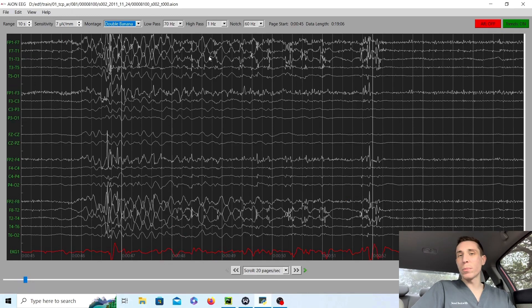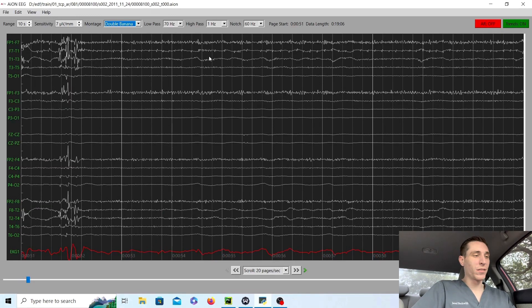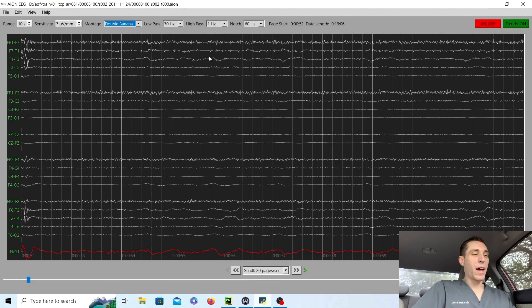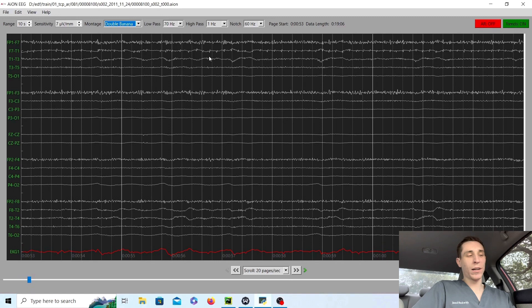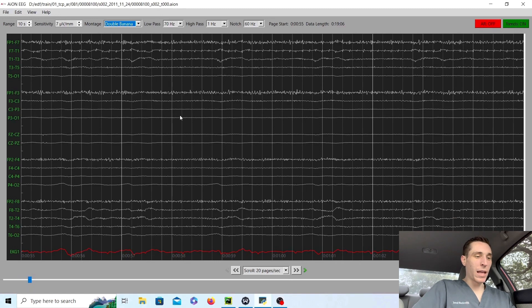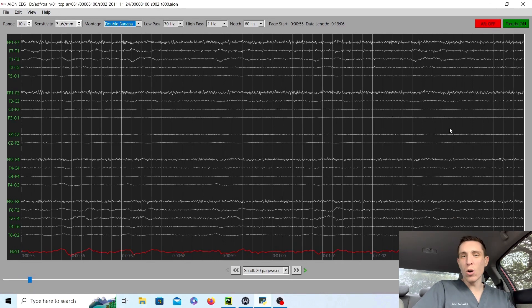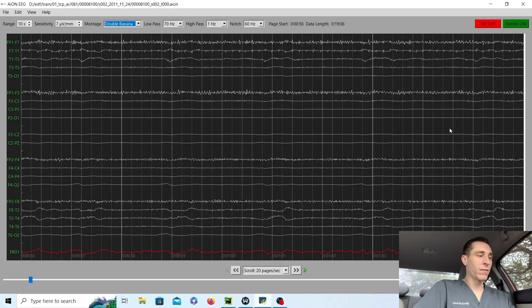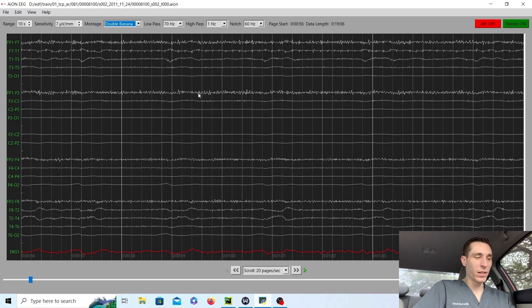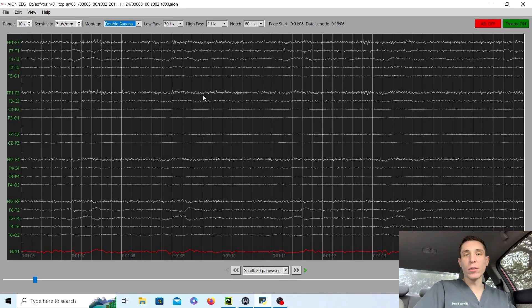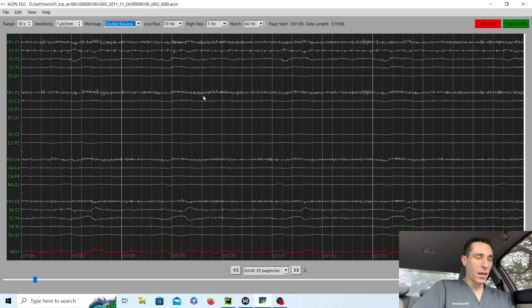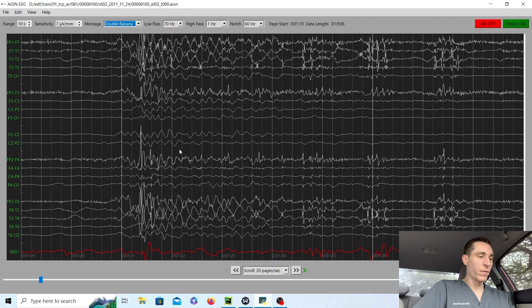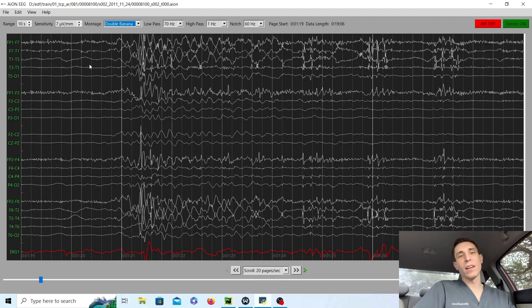So a burst suppression essentially is a pattern where there's pretty much flat line of a record, or very slow waves, one, two, three waves per second. Very flat, very slow in the delta range, and then you have a burst of fast activity.